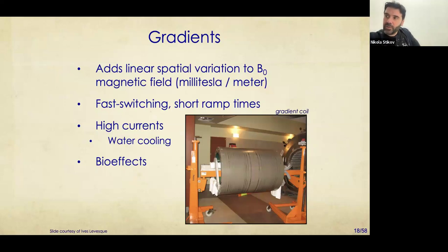There's another weird thing, which is if you're around an MRI magnet and you shake your head, you will get dizzy. Do you know why that is? So think about what's happening. You are standing in a very strong magnetic field, and you have some conductors in your head.